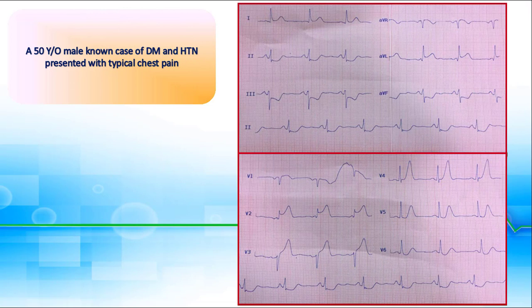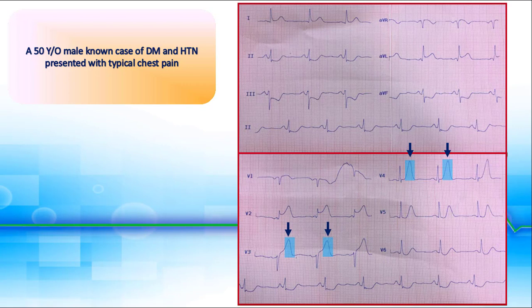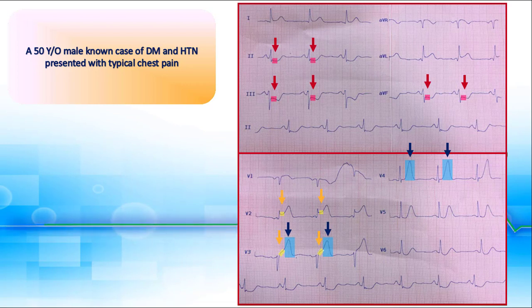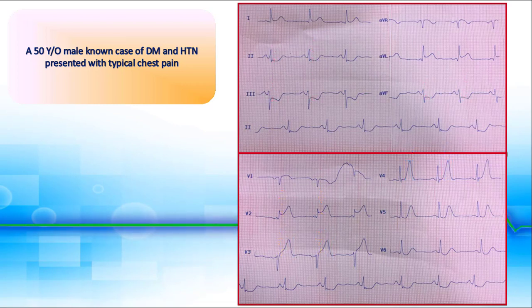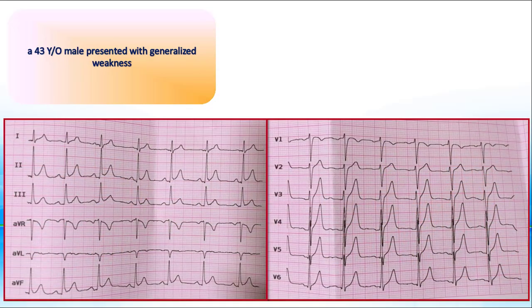This strip belongs to a 50-year-old male, a known case of diabetes and hypertension, presented with typical chest pain. There are broad-based and symmetrical hyper-acute T waves in V3 and V4, with ST elevations in V2 and V3, and reciprocal ST depressions in inferior leads — so acute ischemia is the main diagnosis. The second strip is taken from a 43-year-old male presented with generalized weakness.